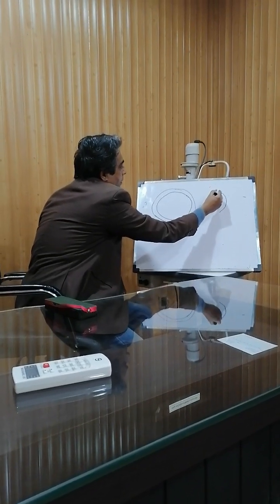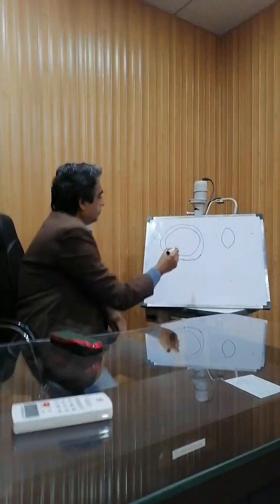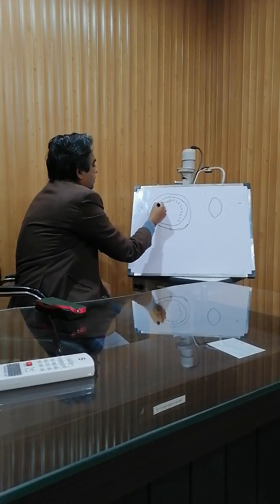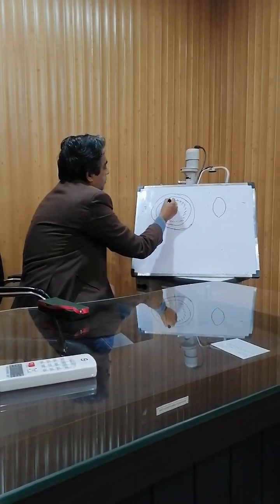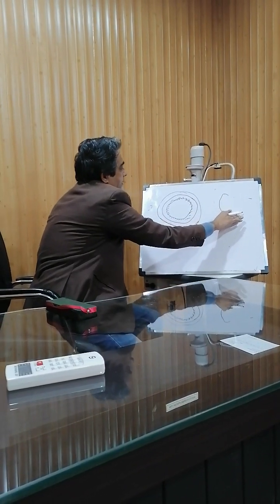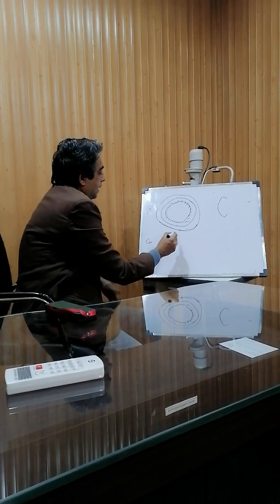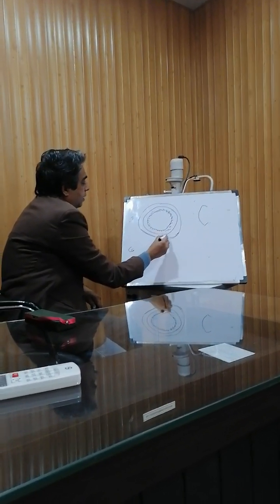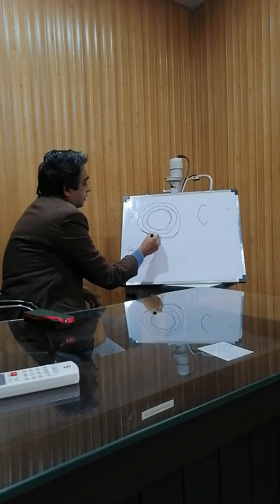You see, this is the sagittal section. With an insulin needle, you curve it, make it a knife, and you start giving incisions like this. It is called can-opener capsulotomy. And then you remove it. It will give you a picture like this. The anterior capsule is removed, and after that, with the corneal scissors, you complete this incision to a full thickness incision.